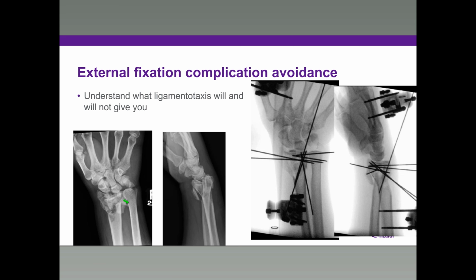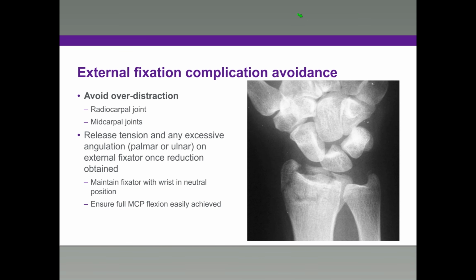You're going to get a lot of length with this, but if you look here, there's an articular fragment down here inside the joint. No amount of pulling in the world is going to reduce that for you, and you need to keep that in mind when you're putting the X-fix on. And the big thing is avoid over-distraction.